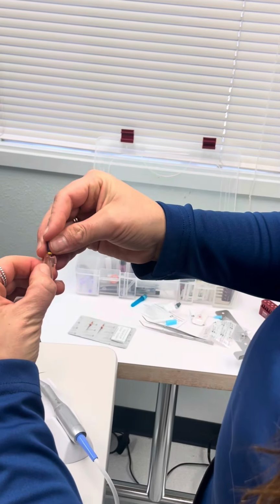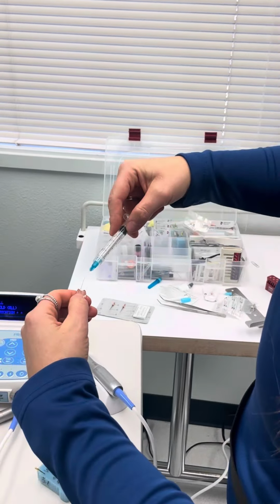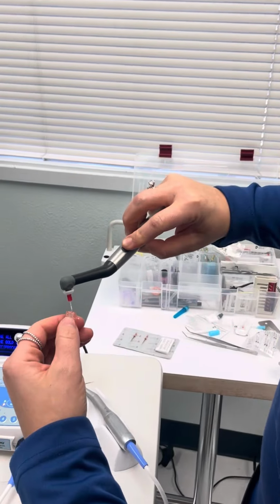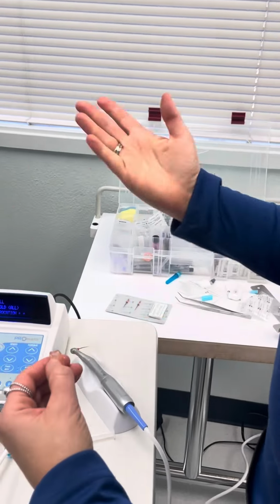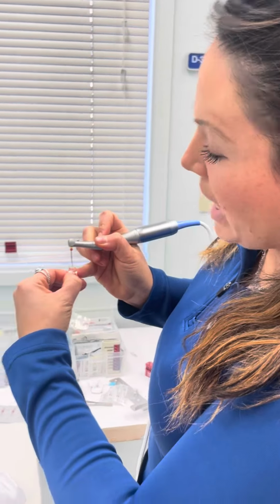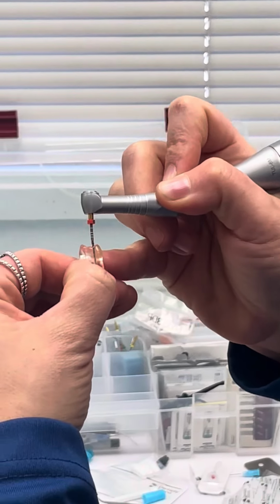I usually have a pretty lame block for this. It's usually just a simple little jig block. Irrigate, endo activate. Whatever pattern of that you want to go through, you're more than welcome. So now I'm going to go to my apical third. I just did my initial third, second third, now apical third.